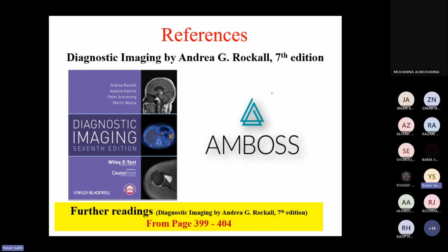All of these last slides are for your future, to help you in reporting the X-ray. These are the things you have to comment on. Do you have any questions?